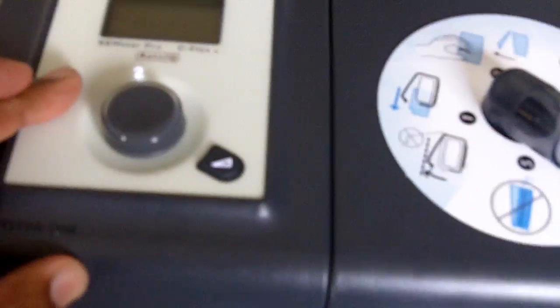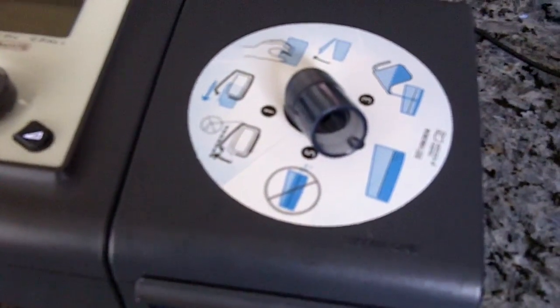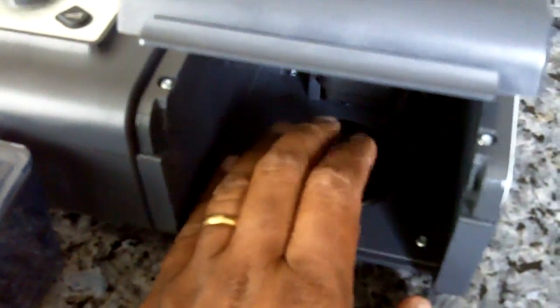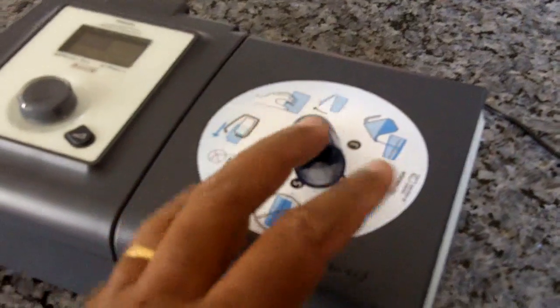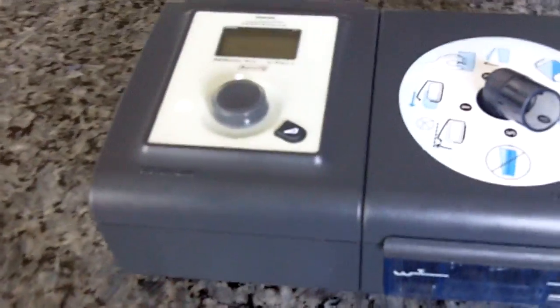Okay. Now, here's the other thing. If you turn your machine on, just like this, and then you wait a minute, and then you just shut it off, you open this, and you touch the heating element, the hot plate, you will not feel it warm. How this works is it needs back pressure. That means the machine needs to feel like you have the mask on your face.